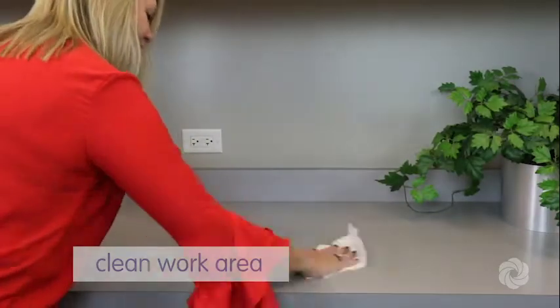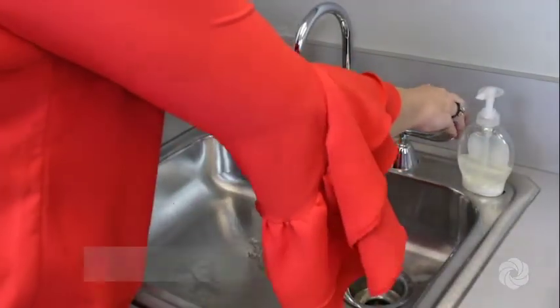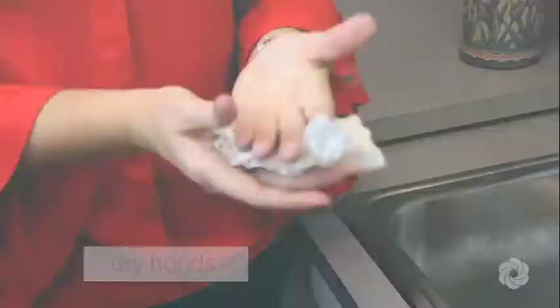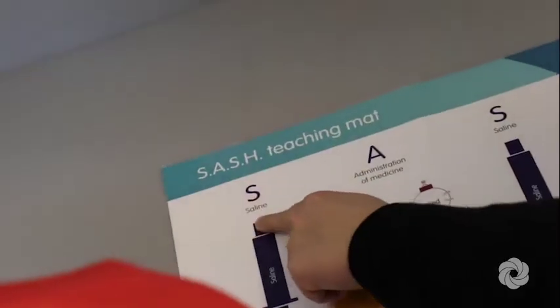Select a clean work area. Once established, clean your hands thoroughly using antibacterial soap and warm water. If no soap and water is available, use an alcohol-based hand sanitizer. Follow by drying your hands with a clean towel. Gather your supplies and prepare your SASH mat as instructed.